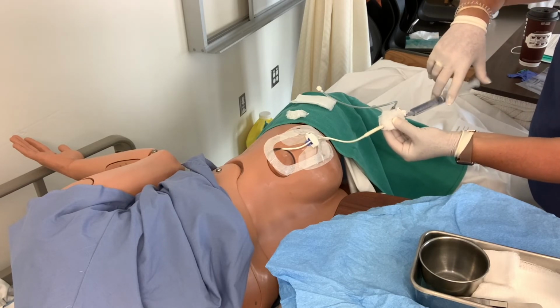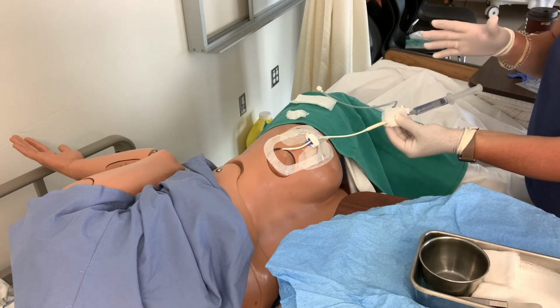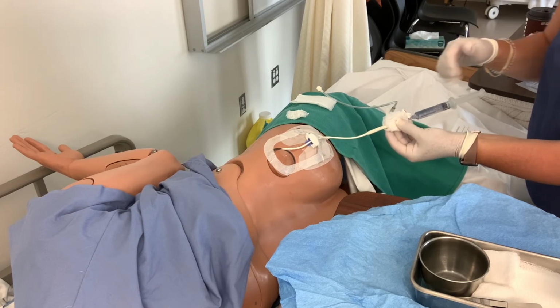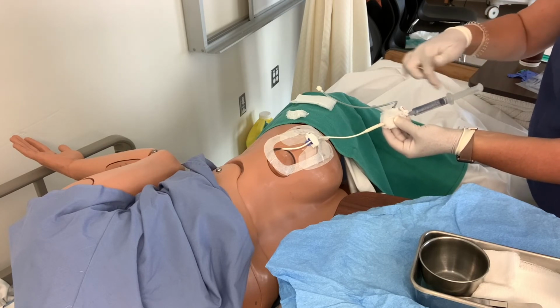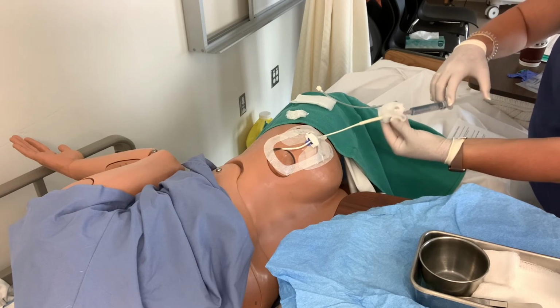Now you might be ordered to flush and aspirate. So if you are, just watch what your order says. If it's flush, just put it in. If it's flush and aspirate 20, you put in 20 and try to get 20 back out. So just follow your doctor's order for that. So that goes in. Before I take this off, I need to close the stopcock.